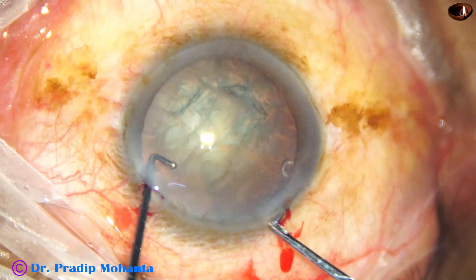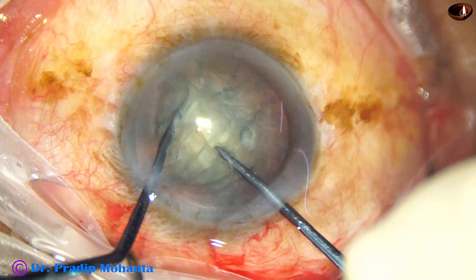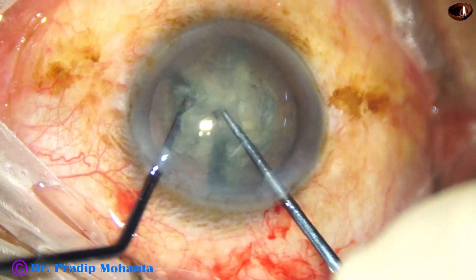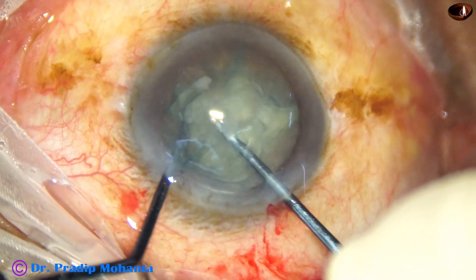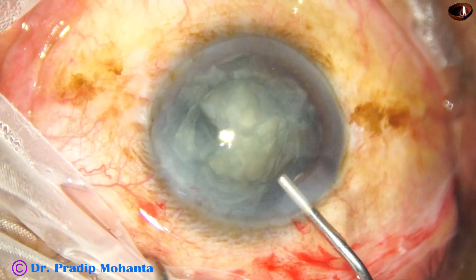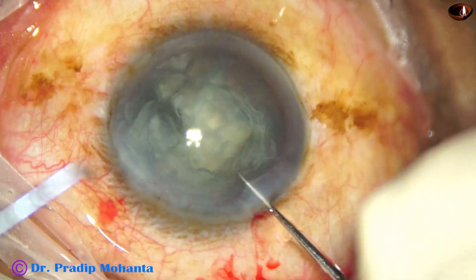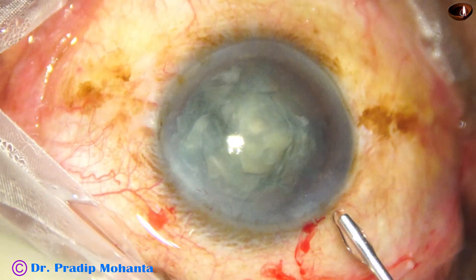I have taken the pre-chopper to divide the nucleus, so the irrigation pressure will be avoided. One hemi-nucleus is divided into two, and this large piece is being attempted to divide into two further pieces. More OVD is injected. Now I am trying to rotate the nucleus, but it is very tough to rotate.